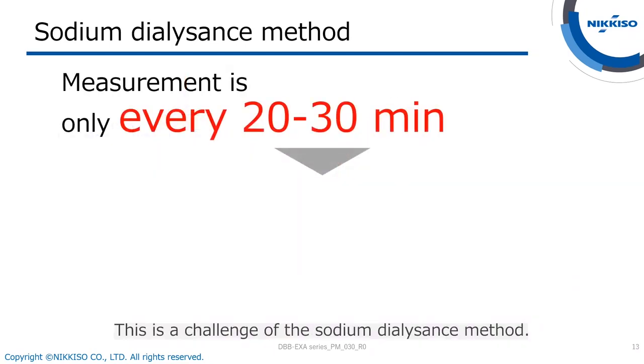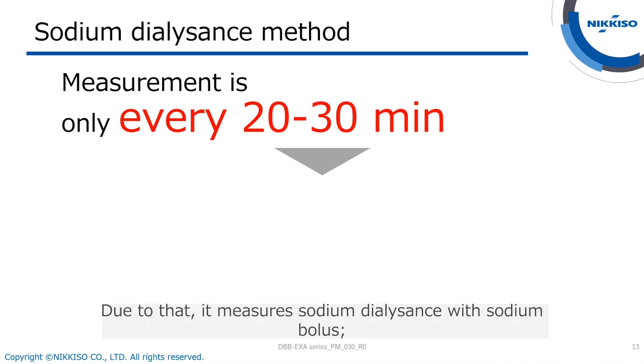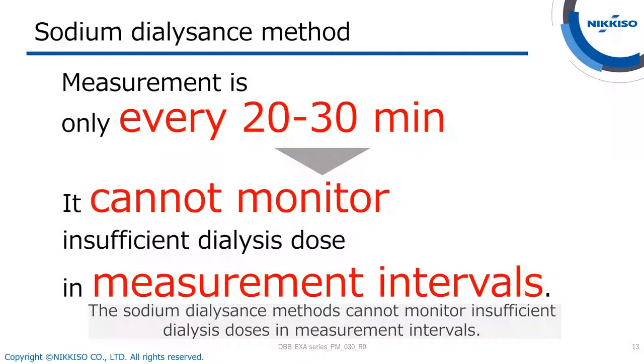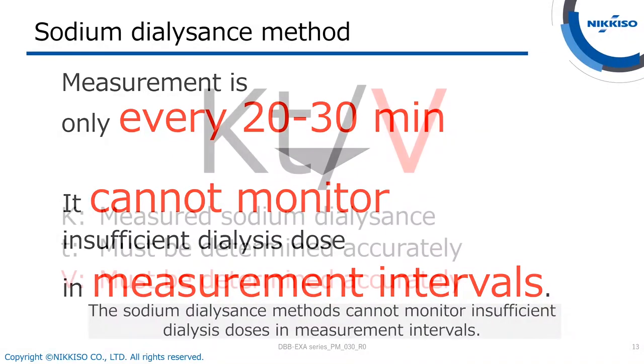This is a challenge of the sodium dialysance method. Due to that, it measures sodium dialysance with sodium bolus, it cannot be continuous. It measures only every 20 to 30 minutes. The sodium dialysance method cannot monitor insufficient dialysis doses in measurement intervals.